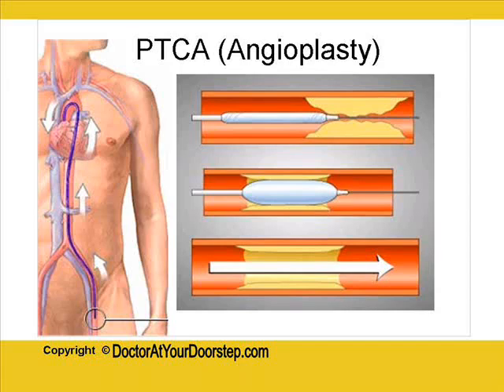It can be inflated from outside. Once it reaches the area, as you can see in the right-sided diagram, where there is a blockage, that deflated balloon is then inflated, and when it inflates, it traumatically breaks down that blockage and opens up the artery for the free flow of blood. Angioplasty has the inherent disadvantage that after some time the chances of re-stenosis, or the blockage occurring once again, are rather high. Therefore it's not a permanent treatment.